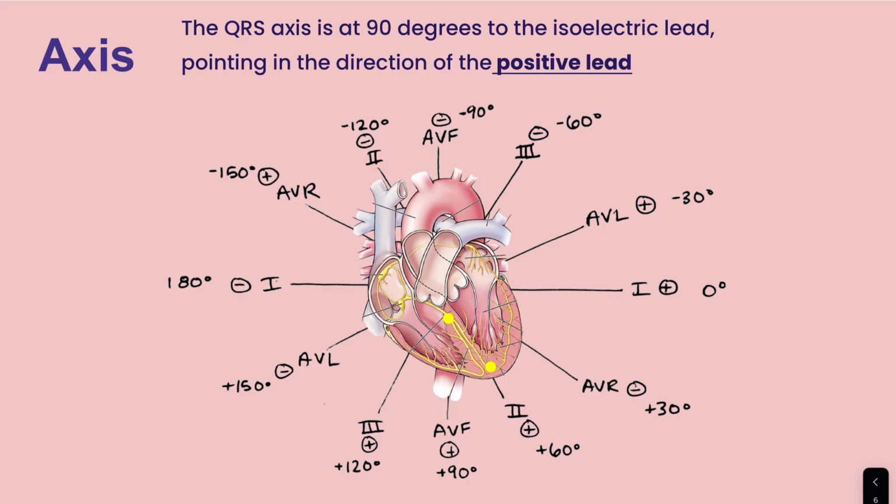This all makes sense. If our flow is going further to the right side in the right ventricle, well, we probably should investigate that a little bit. If we're going a little too far to the left, well, we also should investigate why and see what's happening over there. And if we're going the completely opposite direction, well, absolutely, that's something that we have to look at.